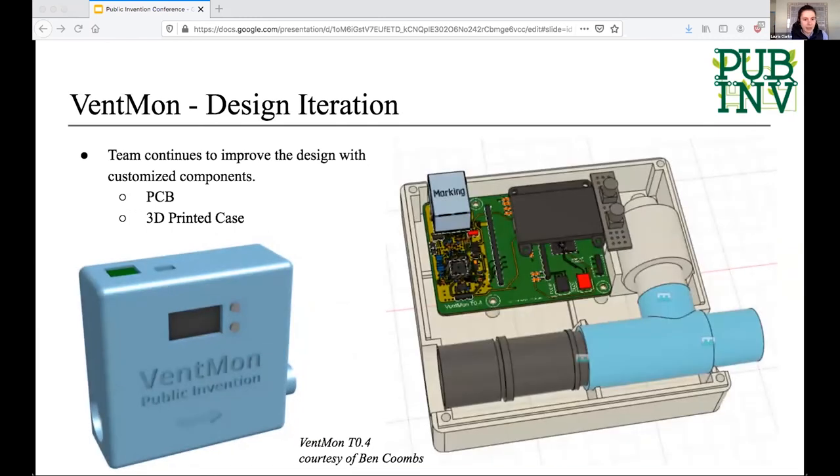The two big things we identified right away were creating a custom PCB to embed all the sensors in a more contained way, and a 3D printed housing. These two images are courtesy of Ben Coons and they're super exciting. This is the next version of Ventmon — version 0.4. You can see a small PCB inside a plastic housing, along with the flow sensors and the oxygen sensor. This is the new Ventmon. It doesn't exist yet, but it's coming soon.